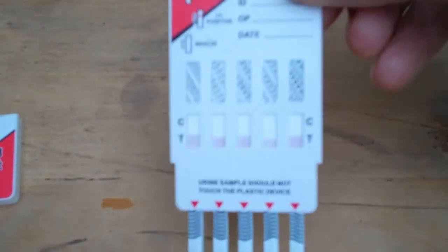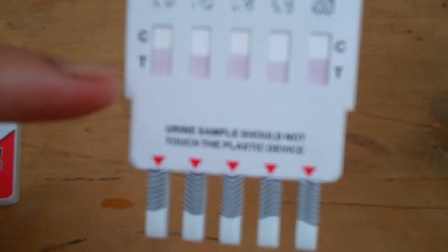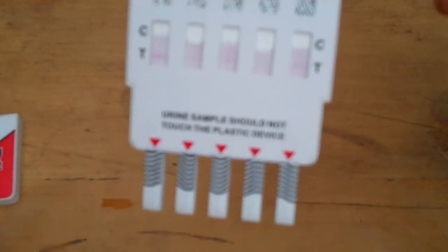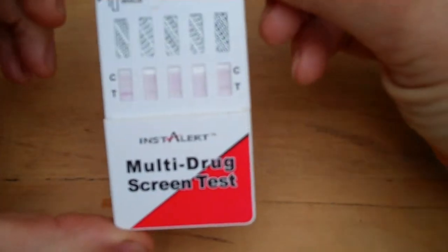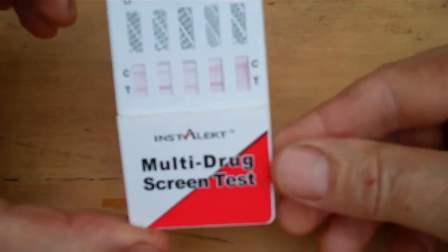If I just take this panel now and apply it into a sample, you need to apply this into a sample for between 3 and 5 seconds. If I bring that back into the view of the camera now, you will see travelling up in the test window area, you'll see the pinkish dye travelling now osmotically up from the prongs where it's been absorbed. And at this stage it's perfectly okay for you to recover the prongs. And we're basically now waiting for the development of control and test lines.